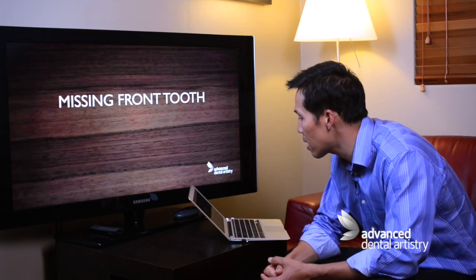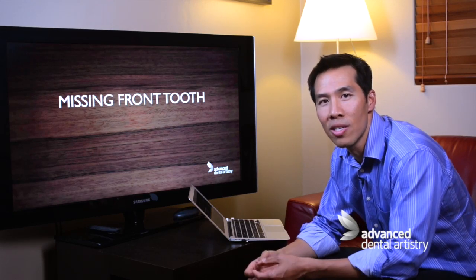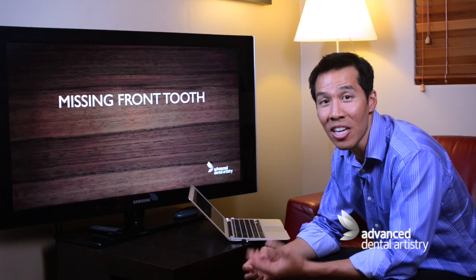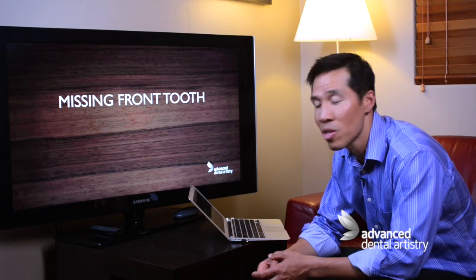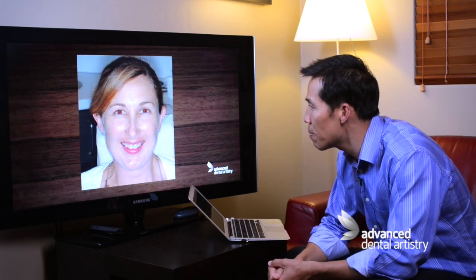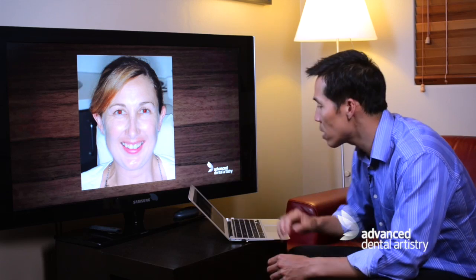Let's look at a case. One of the most difficult cases is a missing front tooth, because not only do you need to get the function back, the appearance is critical, and they're probably the hardest cases to work on. We've got Natalie, who's come in and said that her front tooth is feeling a bit loose. It was knocked before, and it's had root canal treatment.